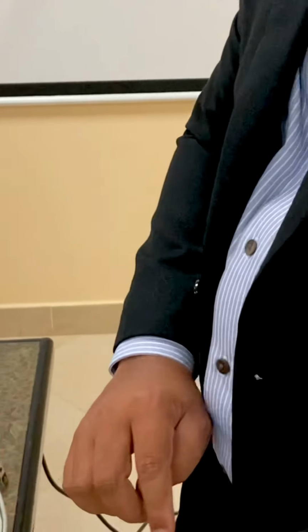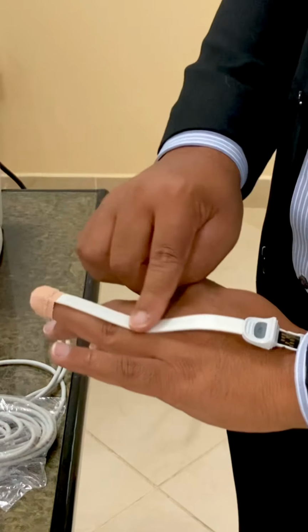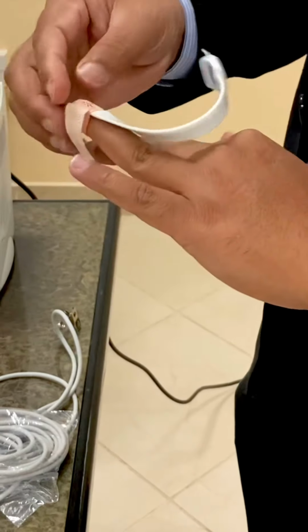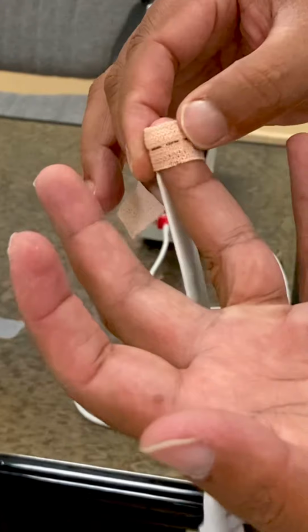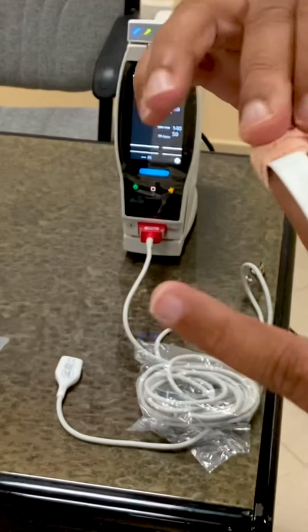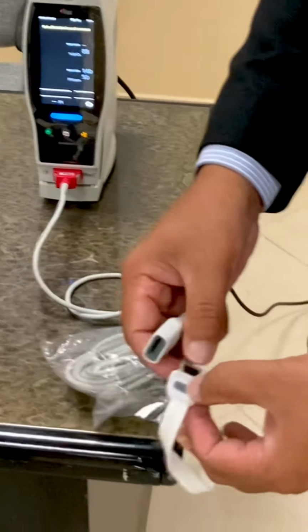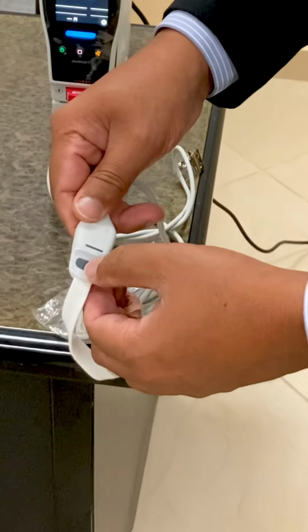So it should be like that, or it can be the other way around, like this cable can be on the other side. It's okay. You mean the downside? No, no. It should always be like this. Because I'll show you. Here you can see the light source, and the detector is here. The light should be here and the detector should always be down. The light should always be on the nail, and then connect it here. You can see the set here and then the cable like this. So these two colors should be together.